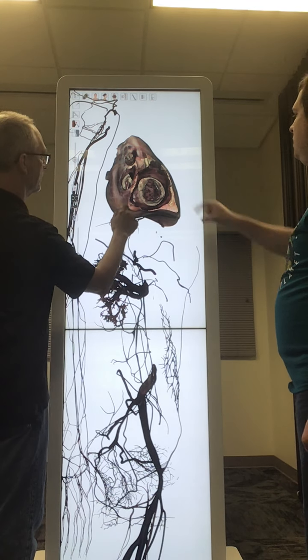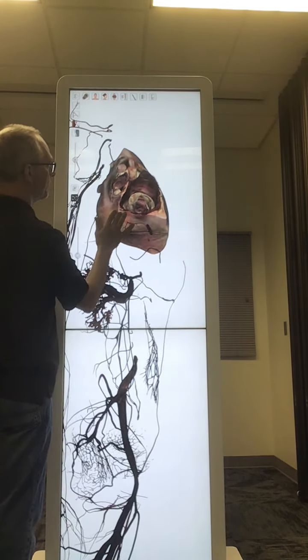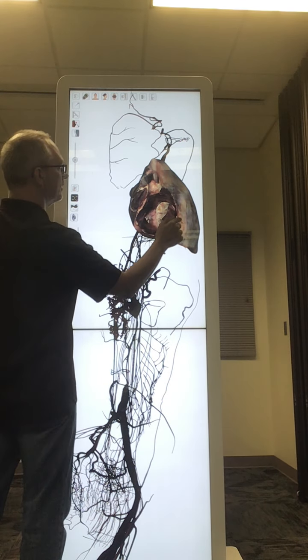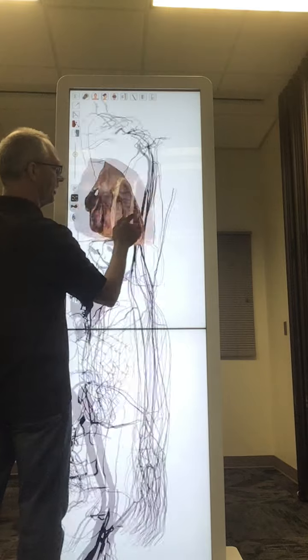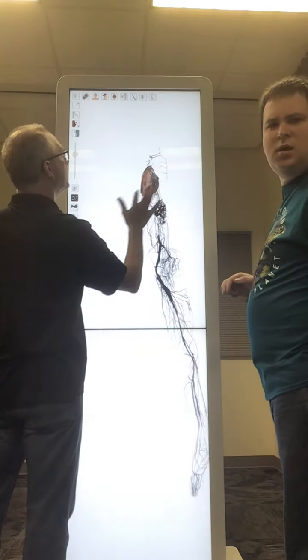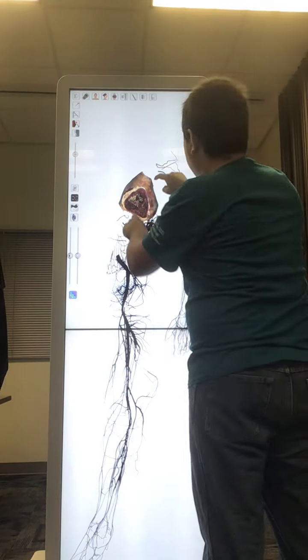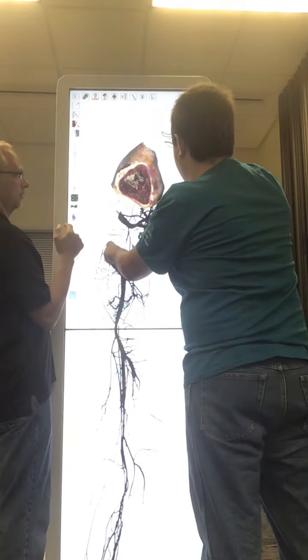Okay, so now you can see the heart. Really nice here that you can see the valve. That's much nicer than what we were doing. It's the cut through the right atrium and right ventricle. And then if we do a slice over here, it's too big. We want it a little bit bigger, use two fingers, there you go. A little bit bigger than that. Yeah, let's go with something like that.